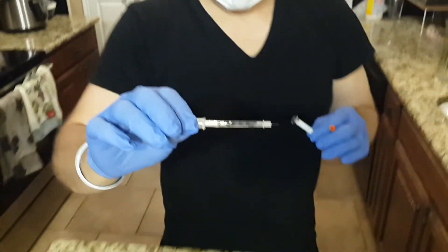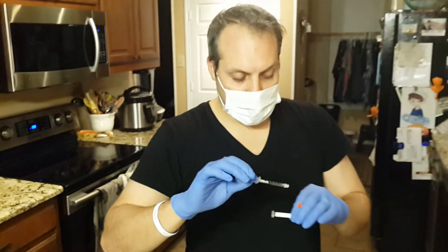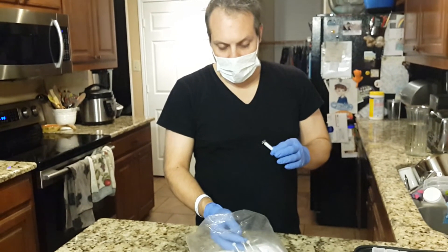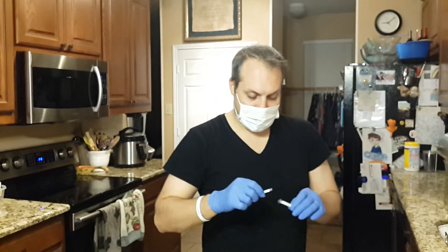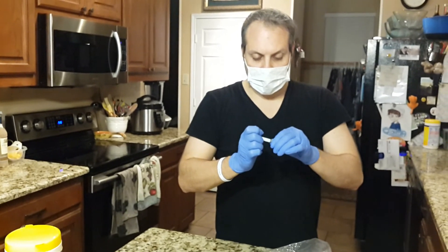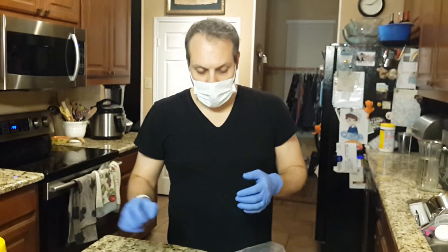So on this last one I've only got about 0.20, and that's because on the first syringe I had that air bubble and probably drew a little too much. This week we're going to have two days of a perfect dose and the third day won't be so perfect. You want to watch your dosages carefully. There was a little left in the bottom there, which isn't ideal.